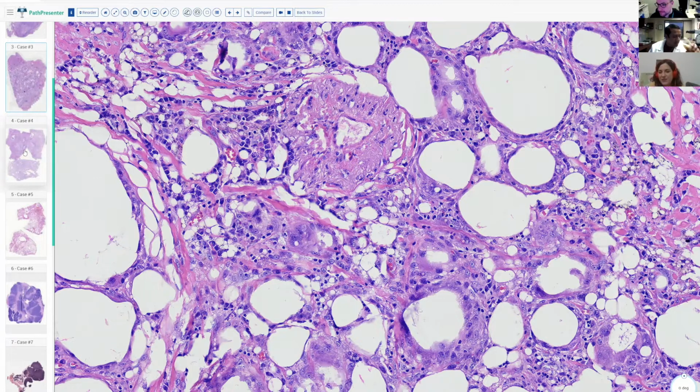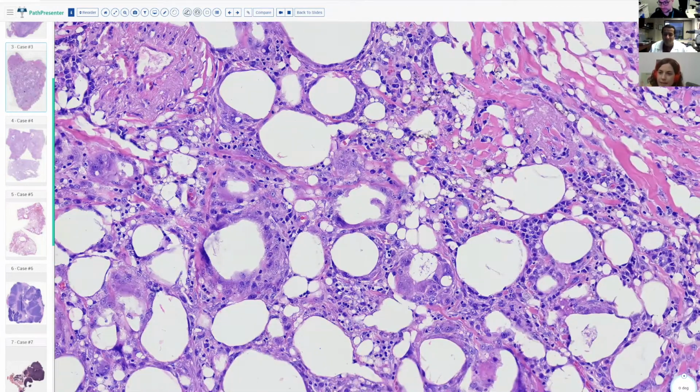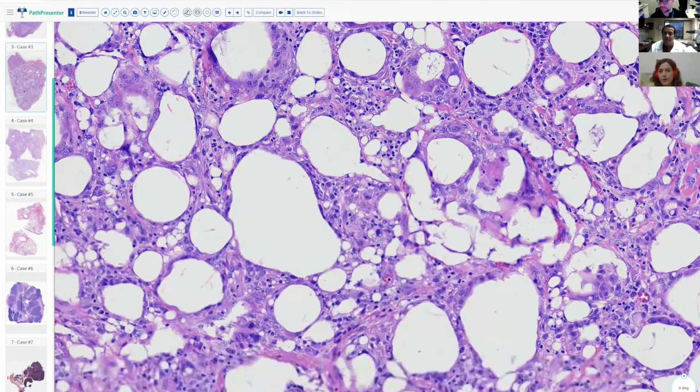Cool. I had one case also on that, and people still don't believe me, because we received that as a mass. It was not in the appropriate lobe. The image was like that, and it took me a while to realize what was happening. I saw the holes and I couldn't see what was happening. I put this in the pathology set for residents, and they don't get it the first time they see it. I have to show the giant cells around the empty spaces, and that case was very beautiful because it had the lipoid pneumonia and also had some food.